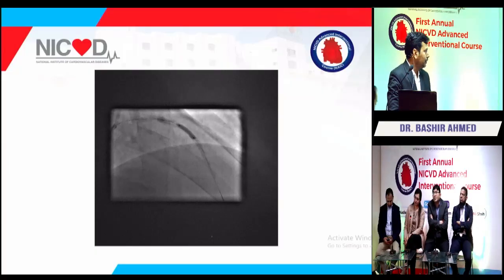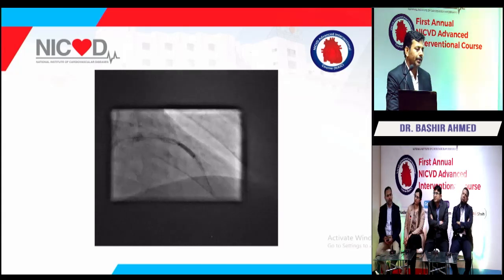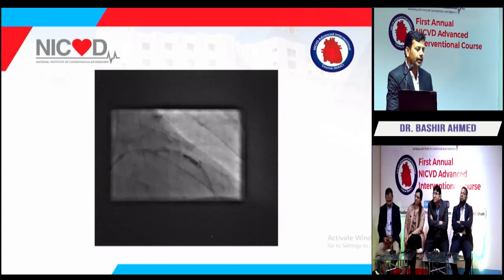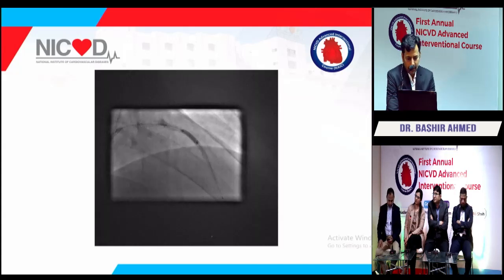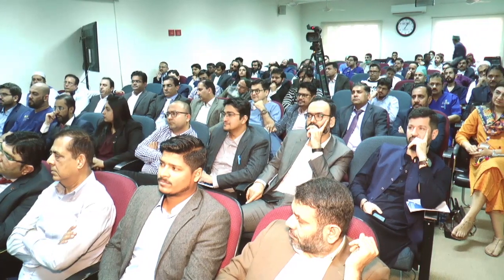As I'm quick to discuss, after the rotational atherectomy we did the IVUS in this case. With the support of pre-dilatation and lesion preparation, even the stent would not cross, and with the support of a guide liner, we distally placed the stent, and then the other stent was placed without guide liner support, and then the patient was post-dilated, and the whole procedure went uneventful and successful.